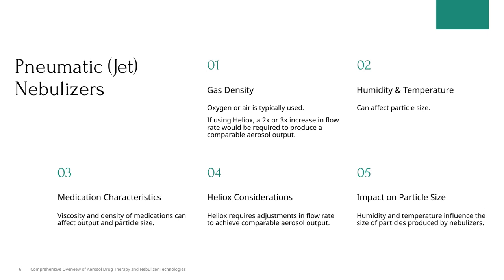Considering medication characteristics, the viscosity and density of the drugs themselves can influence how much gets aerosolized and the size of the particles produced. Thicker or denser medications might require different settings or equipment adjustments. Finally, most of the gases used are either oxygen or air.